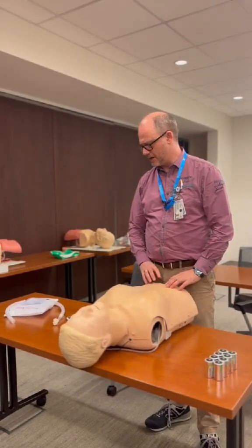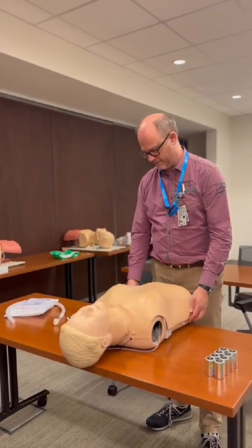This time we're going to change the lungs and the battery for the Resuscitation Mannequin.